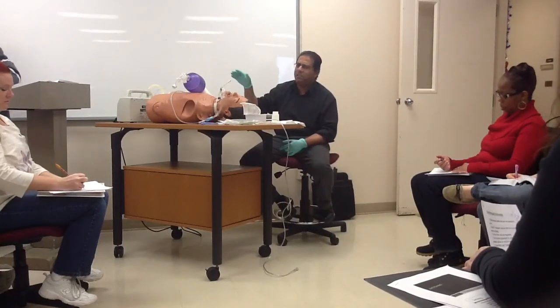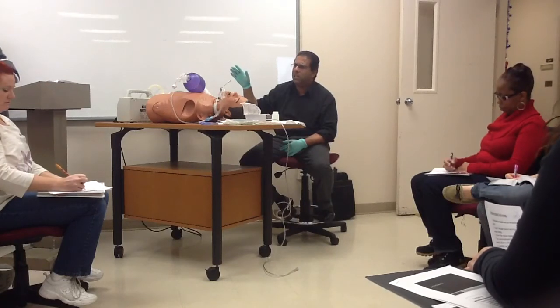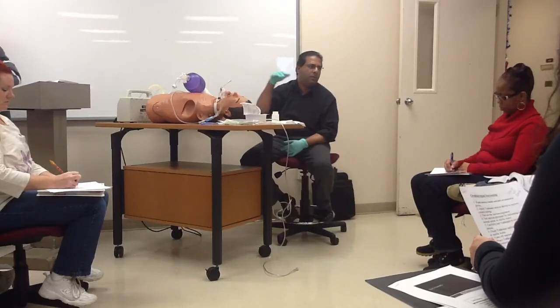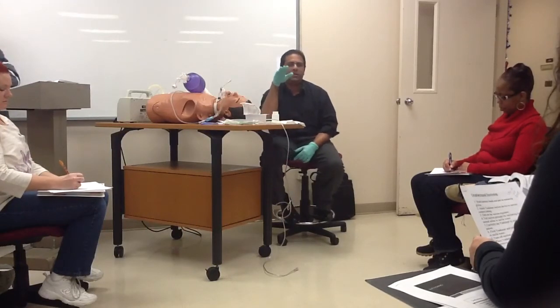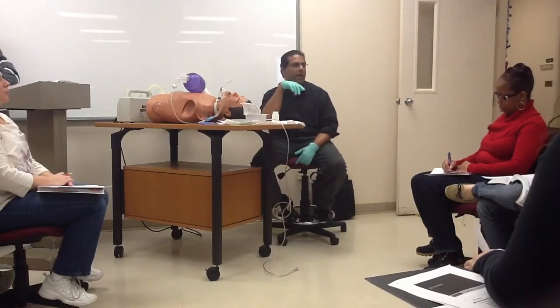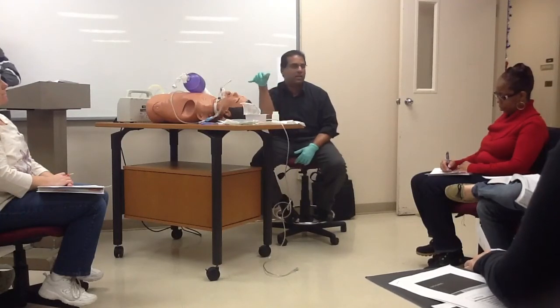I've never seen a suction catheter of 16. I think the 14 is the largest that I saw. So you can actually go down to 12 or 14 before the number 8. That's pediatrics, a whole different world. You're small. So this is the main difference with suctioning the trach.